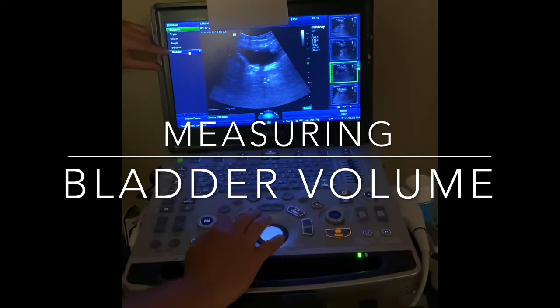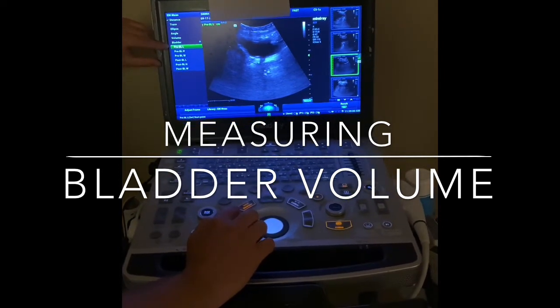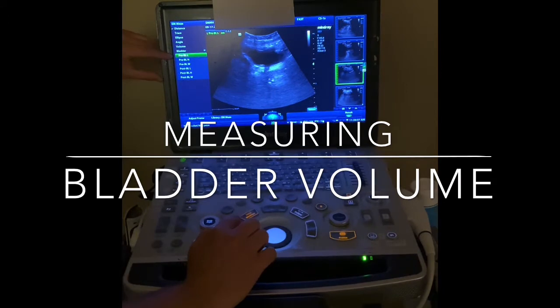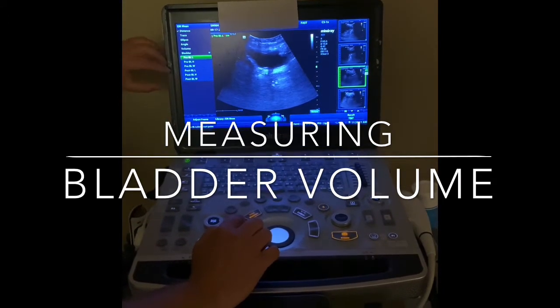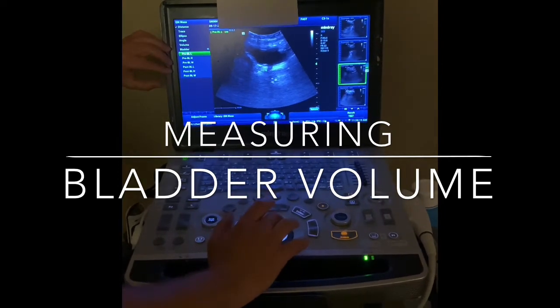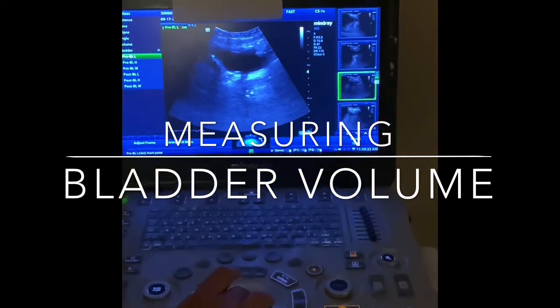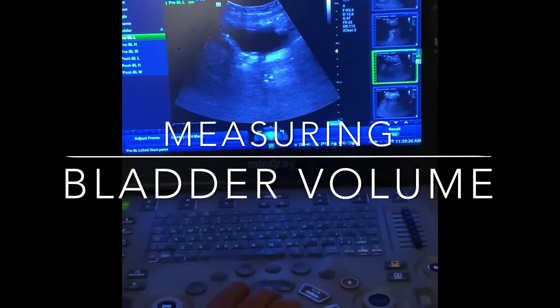If I select bladder, you can see that I have multiple settings. There's pre and post bladder length, height, and width. For our purposes making one measurement, it does not matter if we select pre or post. This is just for labeling if you're doing this at the level of a tech. Right now, the bladder length is automatically selected. What is labeled length, height, or width for our purposes doesn't matter, as it doesn't affect the calculation.